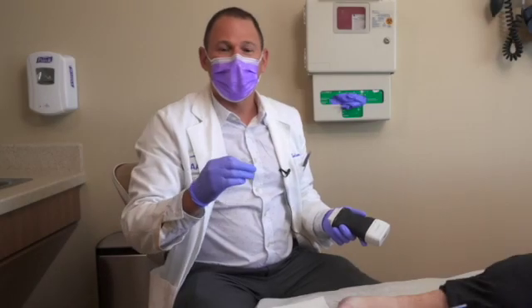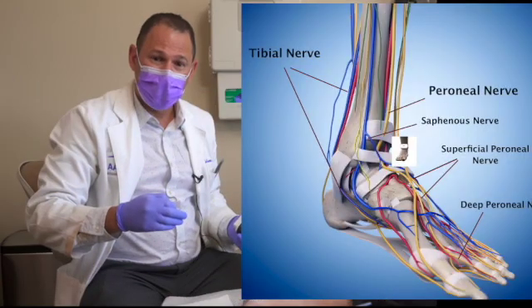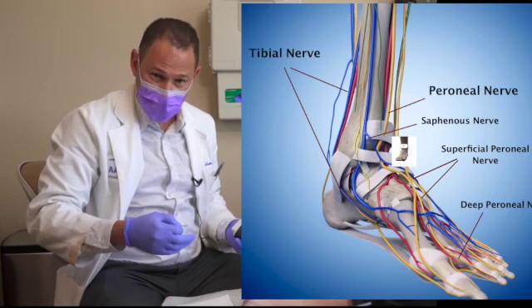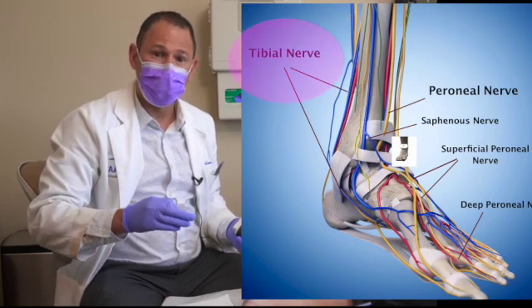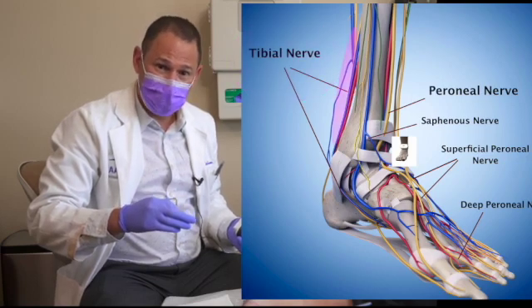This patient is suffering from plantar fasciitis related to a heel spur. I'm going to give her a PRP injection — platelet-rich plasma — to reduce inflammation and promote healing. Prior to doing that, I'm going to give her a tibial nerve block to reduce the pain so that I don't need to put any local anesthetic with my PRP. I don't want anything to interfere with the activity of the PRP. So I'm going to go proximal to the tibial nerve, which innervates the medial and inferior aspect of the foot, and will hopefully give her enough anesthesia for the procedure.